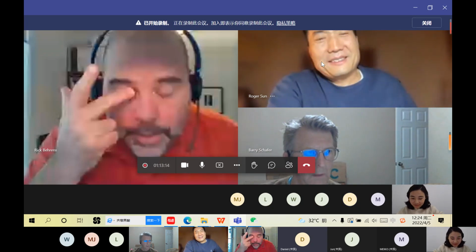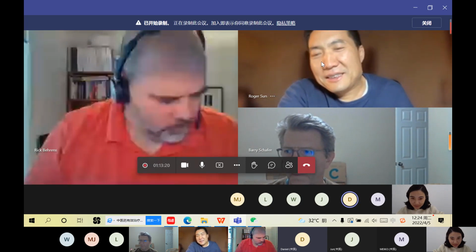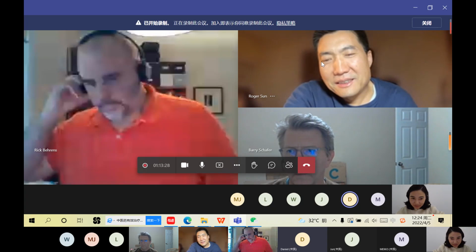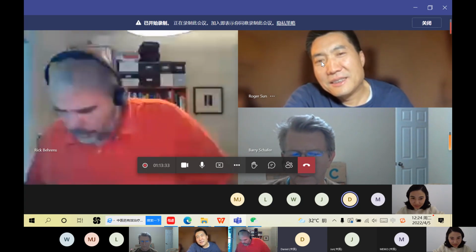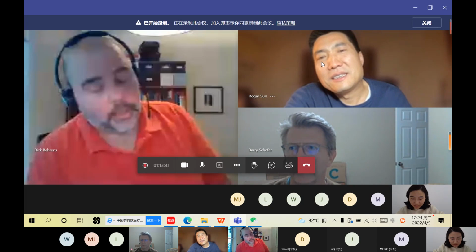Hi, Rick. I think there is another possibility: we need maybe 6 to 8 scans to generate a 360-degree image. Maybe for this patient, we only did 1 or 2 directions. That could be another possibility. Yeah. And I will also show you something. Here, I'll share my screen.